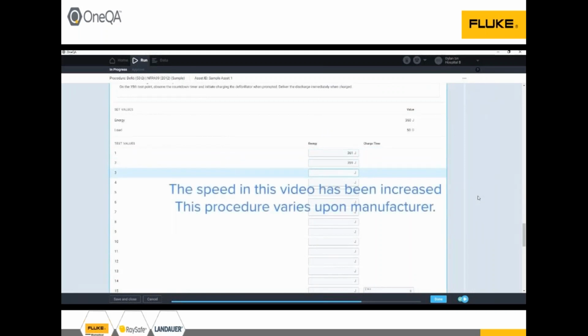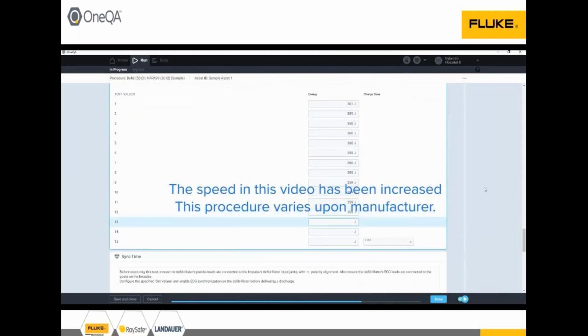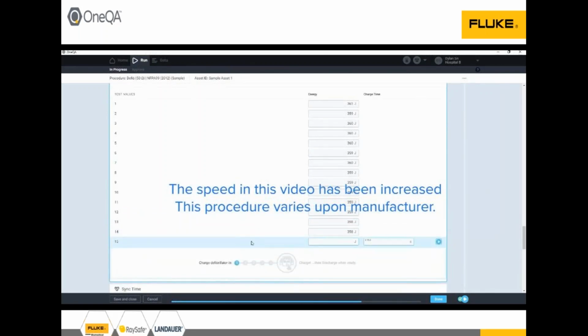And another thing that happens is the only thing you gotta do is, as you guys can see, there's a blue bar in the row. That is I'm activating that specific step. And once I activate that step, you press play, and the software runs the connected device. The software has all the controls. The procedures are inside the software, so perhaps you might have automated your Fluke equipment in the hardware. Now you don't have to.